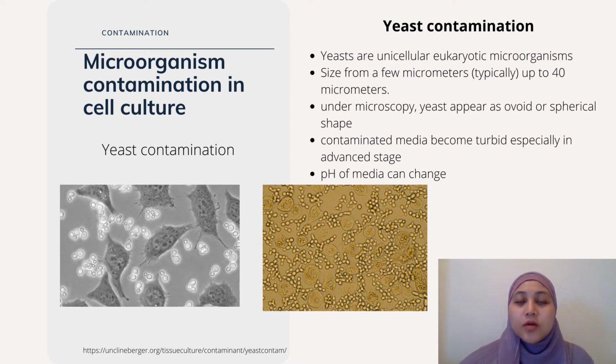Cell culture contamination can be due to yeast contamination. Yeasts are unicellular eukaryotic microorganisms. They vary in size between 5 to 10 micrometer and up to 40 micrometer. When you look under the microscope, yeast appear as ovoid or spherical shape. You can recognize the presence of yeast in your cell culture when looking at the color of your media. Your media can turn turbid, especially in advanced stage. The pH of media may also change, and under microscopic examination, yeast can appear as single cells or change form or branches.